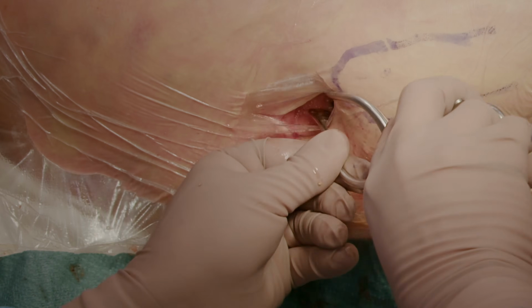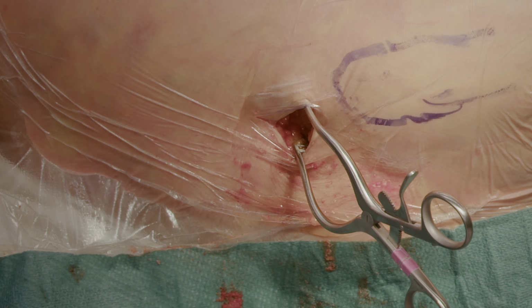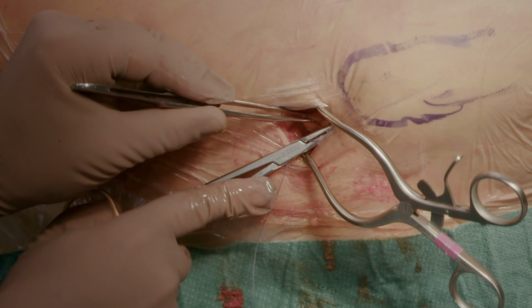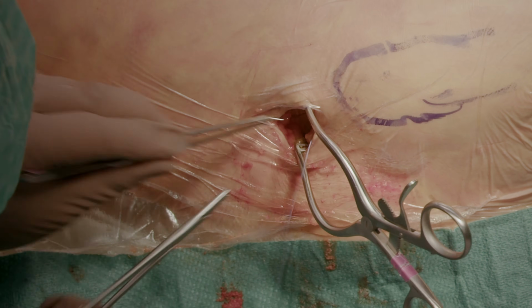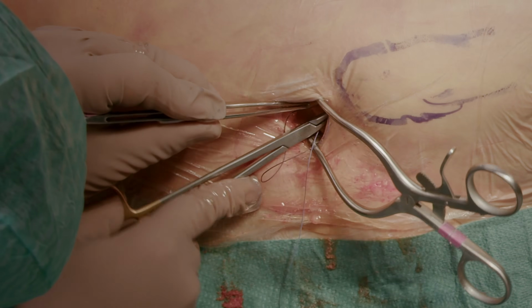We use absorbable sutures, Vicryl 0, for example. Close the fascia first, then the subcutaneous layer, and finally the skin. Hemostasis should be checked.